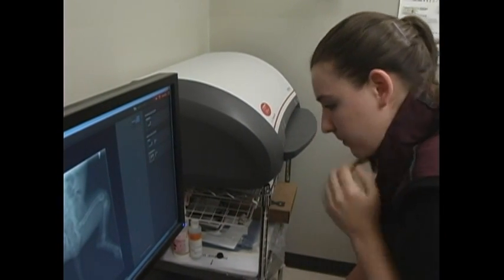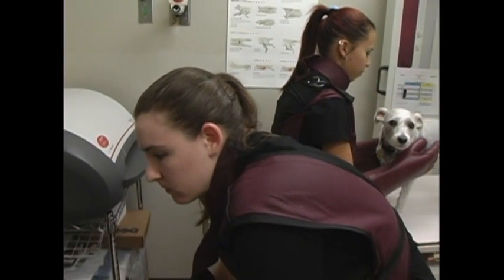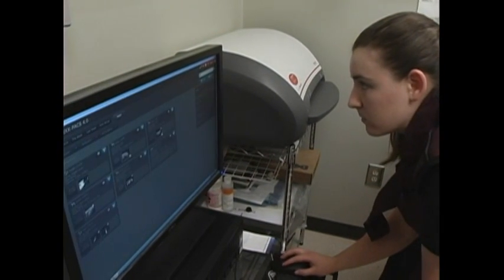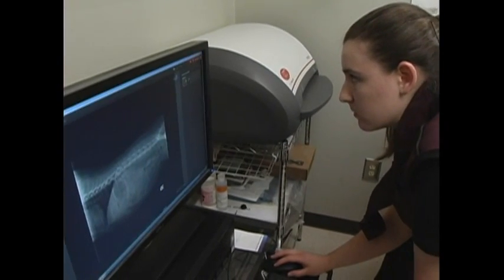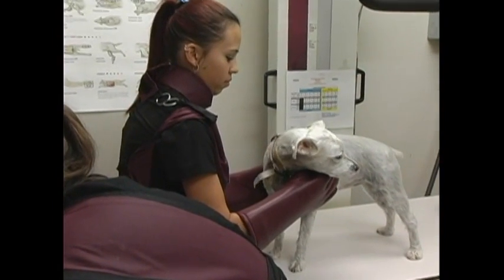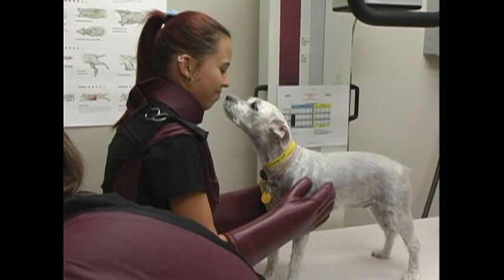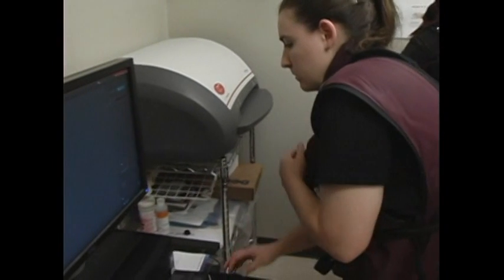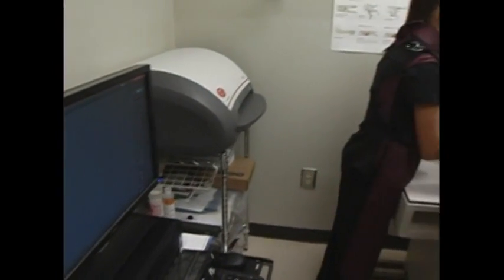This is Kristen. Kristen is getting ready here, setting up the digital machine, and I just love digital radiology. It is so much better than the old days because the quality of the film is just fantastic, and we'll talk about that more later. As you can see, Isabel's resting quite comfortably right now. She's relaxed, and that's one of the main points I want to make: this is a non-invasive procedure and very easy to do. On occasion, some pets have to be sedated because they're anxious. As you know, with radiographs, they have to be still. So that's always the challenge, to make sure that when we take the image they're still.